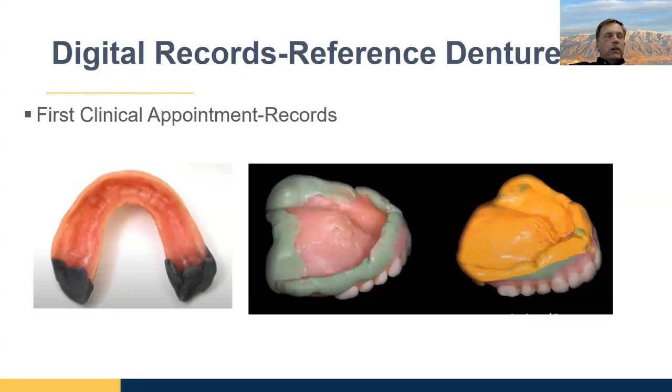But yes, even though printed dentures are a composite material, technically speaking, you can use a carbide on them like you would. You'll find they grind differently than acrylic, but they're not that different. The powder they produce is different, but the feel is not that different. You can polish them up with pumice just like you would for a standard acrylic denture.